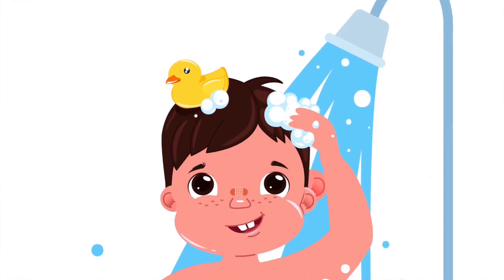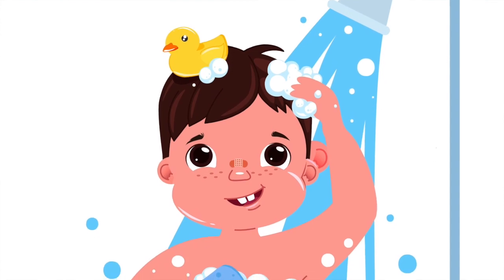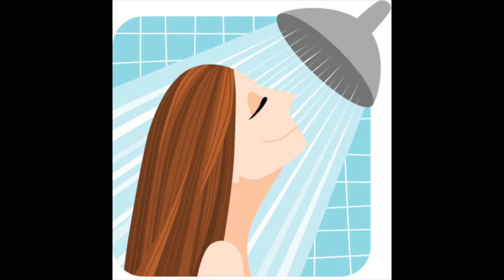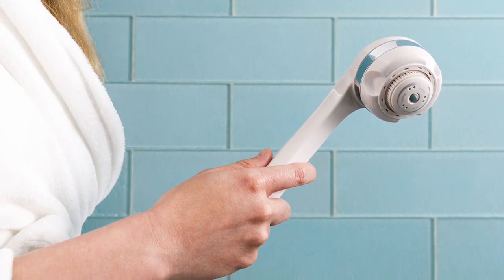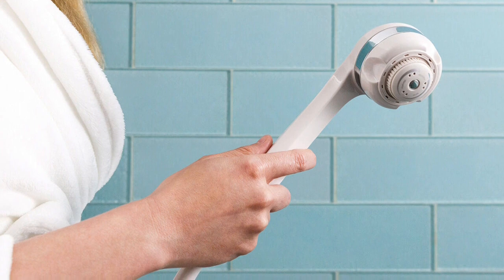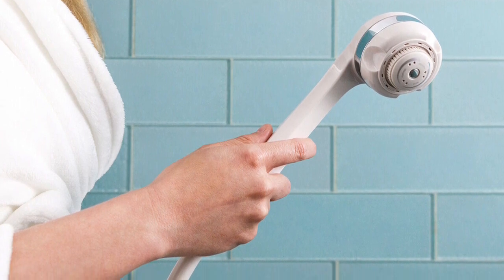When showering, it is best to shower with your back towards the water. Please do not shower with your face in the water. It is best to avoid pointing the shower head at the level of the tracheostomy tube or ventilator. It may also be helpful to shower with a hand-held shower wand, as this allows the water from the shower head to be more finely controlled.